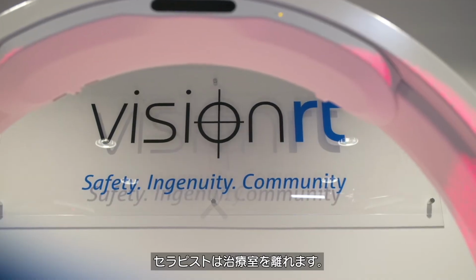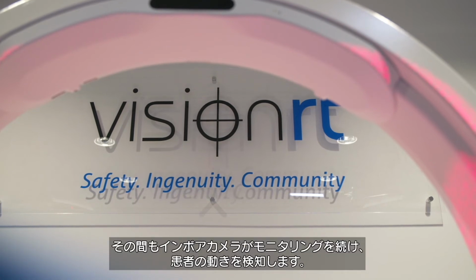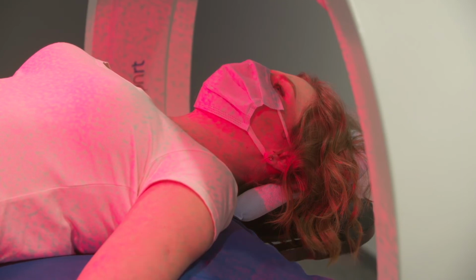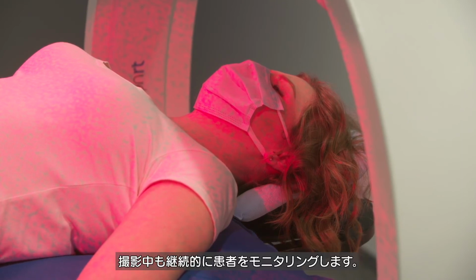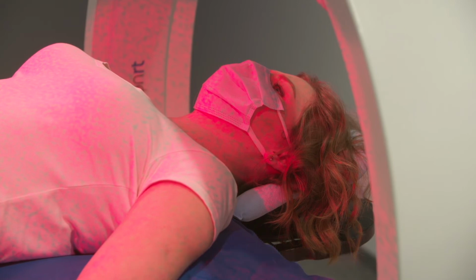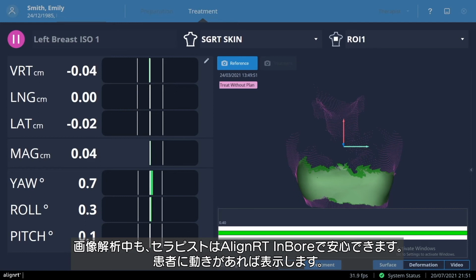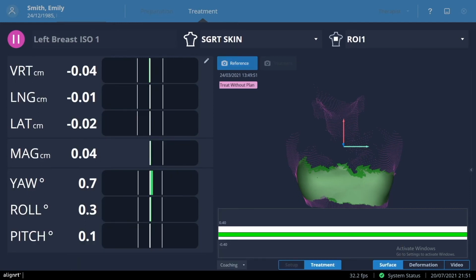The therapist can then leave the treatment bunker while the in-bore cameras continue monitoring the patient to ensure any movement is detected. The patient is continuously monitored while internal imaging is performed. While analyzing the images, the therapist can rely on AlignRT Inbore to flag any patient motion.